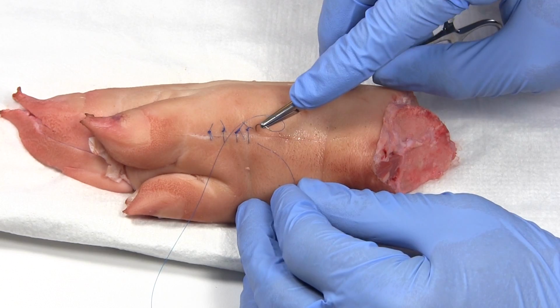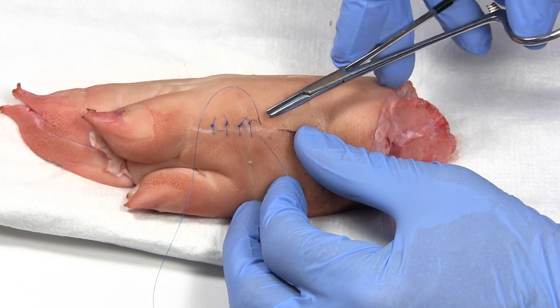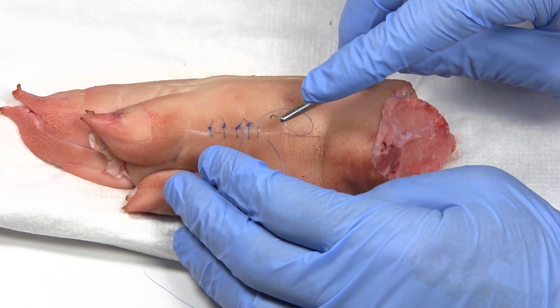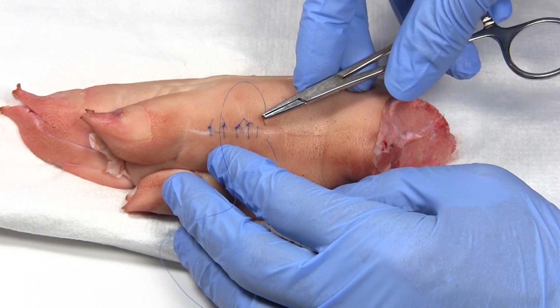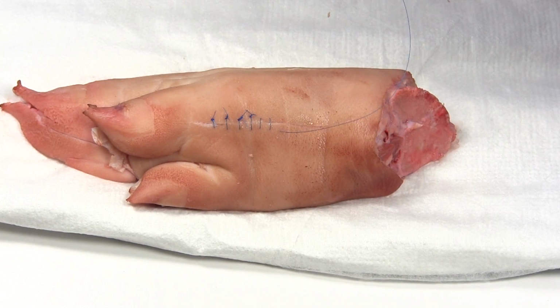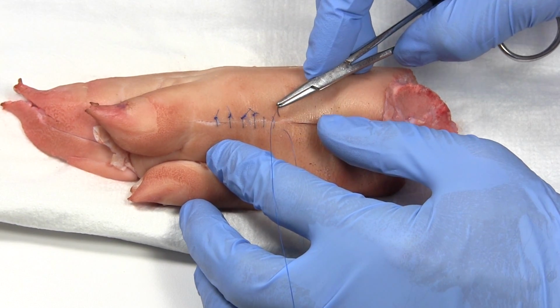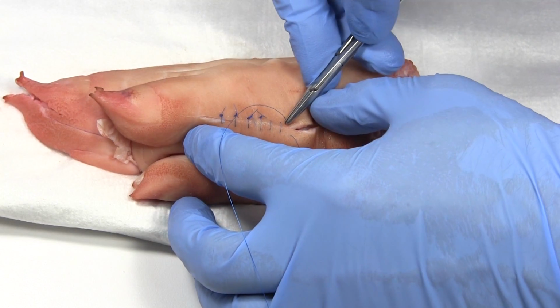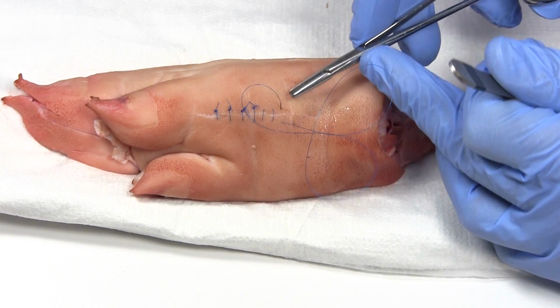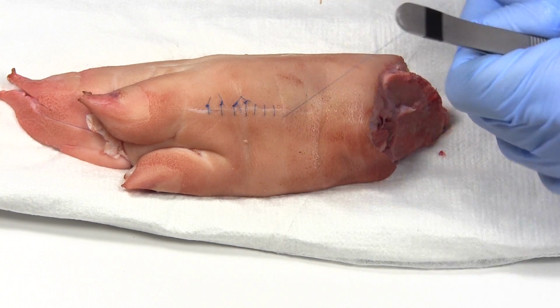So you go straight across, down in. Now you want to angle this just a little bit over to the side, so it comes out next to that previous suture. And pull it through. And then you just continue on with that exact same technique, straight across. Angle a little bit to the side. Pull it through. Straight across. A little bit to the side. One's a little bit deeper here. A little bit to the side and pull it through. So you would go on like that for the length of the wound.